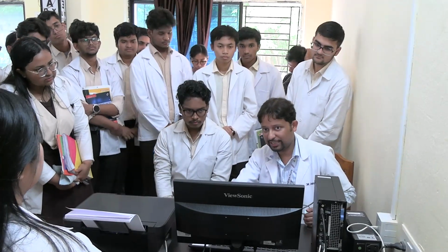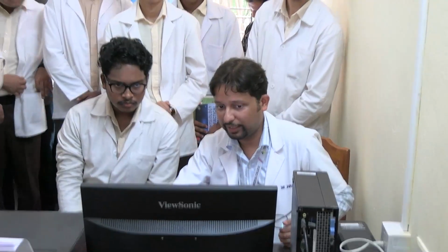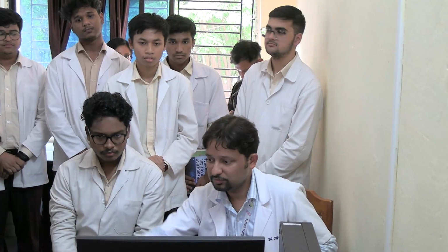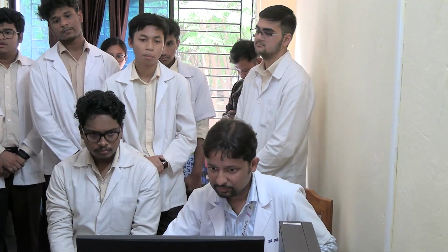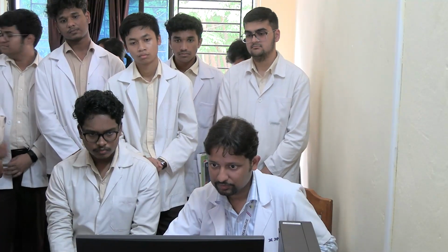Maneuver 2 is saved as he's recording. Done. So after this, you can directly go to result. So you'll get the entire panel for comparison. Okay. So now we'll have one more. So we'll have few recordings more.